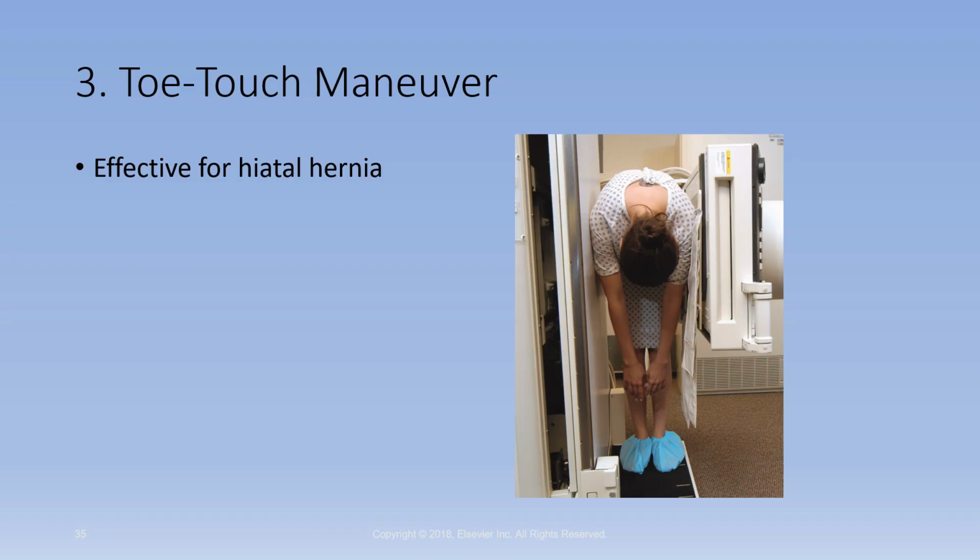There's a picture of the toe touch. This is actually a picture of the footboard that gets attached to the table. You can see this gap. So the bucky is not pulled down like it should. And this is the gap that we're talking about, that bucky slot shield covers. Because that's a pretty significant gap.